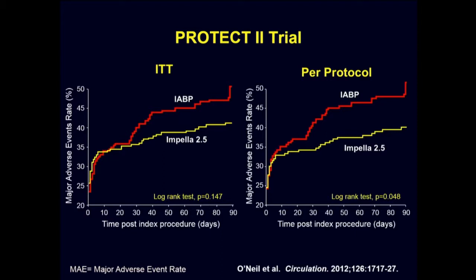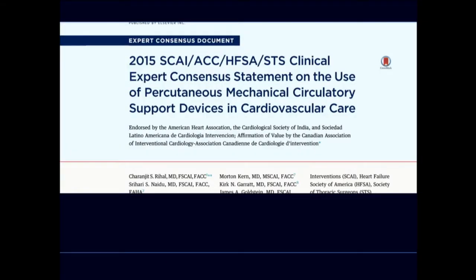I think there are cases where we certainly get away with stuff we wouldn't. But for sure we can say that it allows the physician to do a more complete revascularization, do a better job if you need to do rotablator like Cal's case. I know Stefan was mentioning if you have to do rotablator in a patient with a terrible ventricle, you're almost asking for trouble, so it's nice to have support.